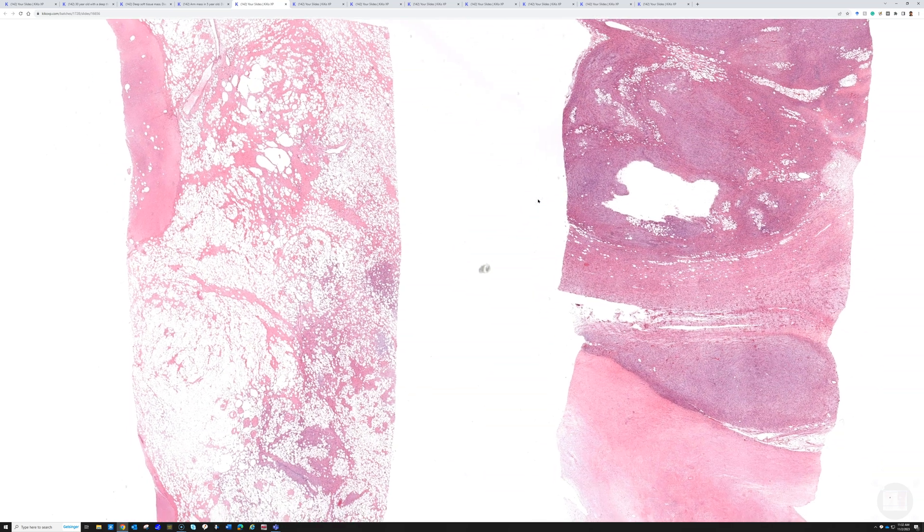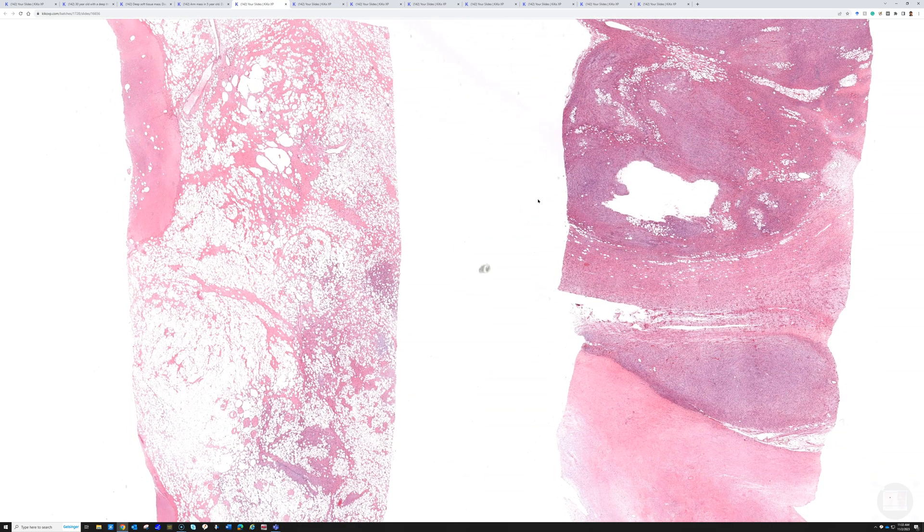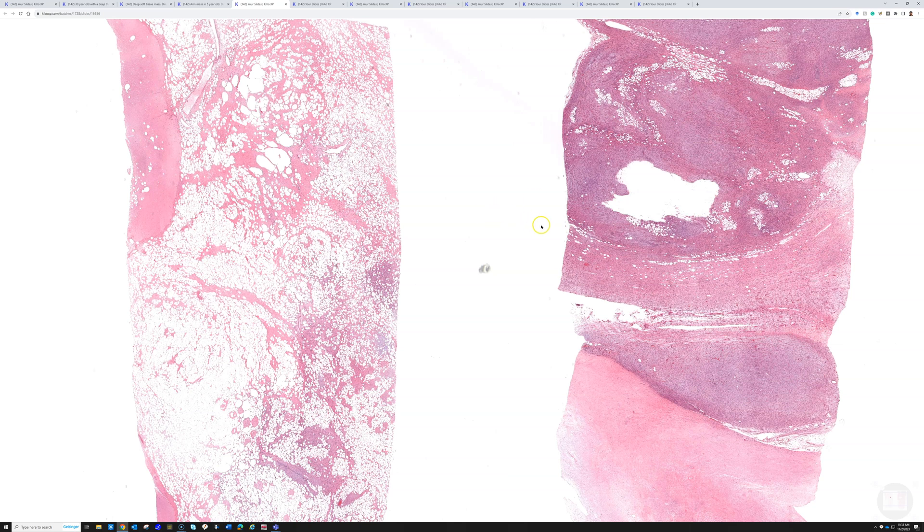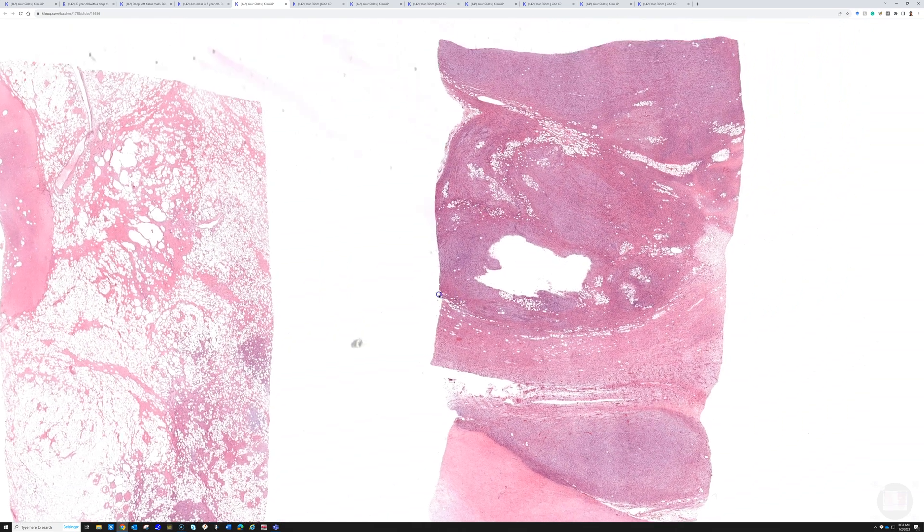Now, let's look at a totally different fatty tumor. This is from a large mass from the retroperitoneum of an adult.